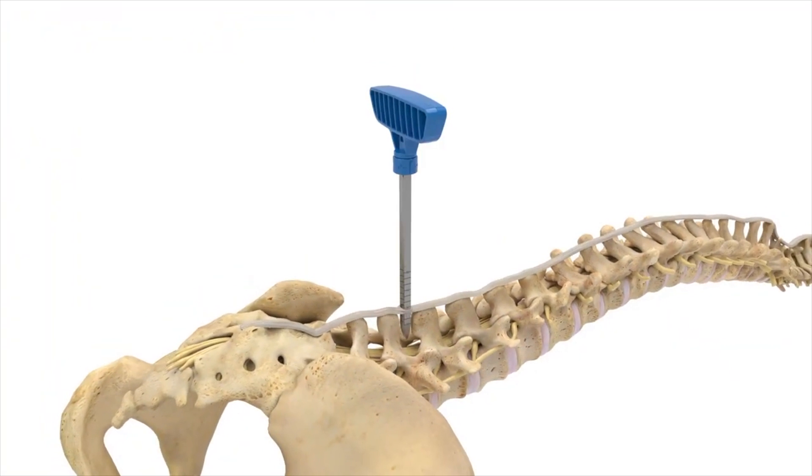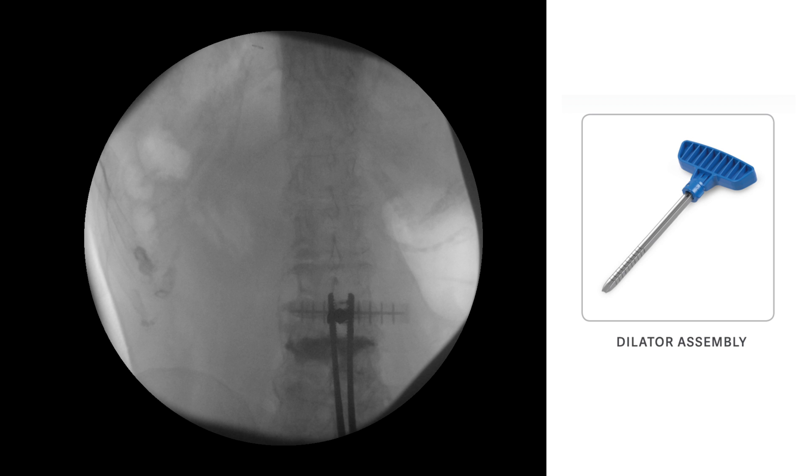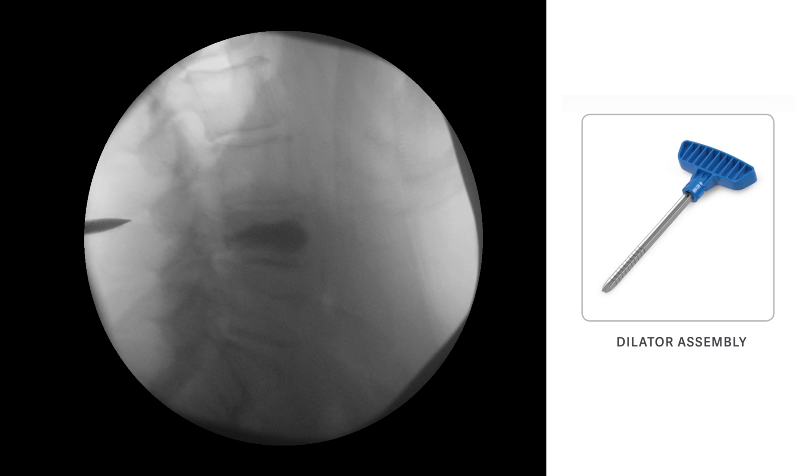Next, the dilator assembly is introduced at midline and visualized in the midline position between spinous processes. The assembly is then advanced with the assistance of a mallet until the distal tip approaches the dorsal aspect of the facet shadow or spinal laminar line.